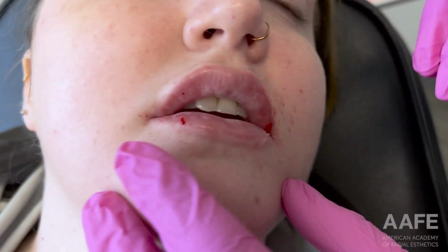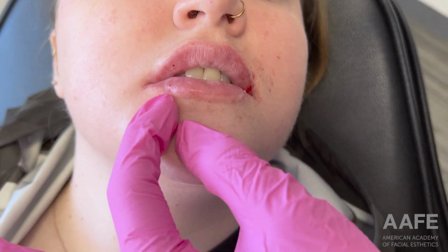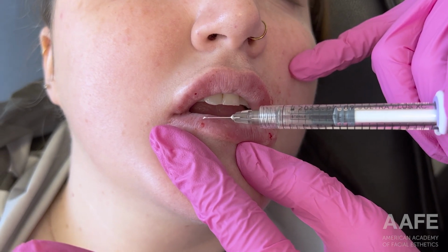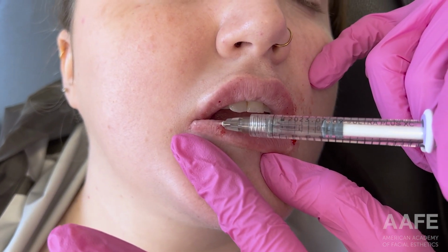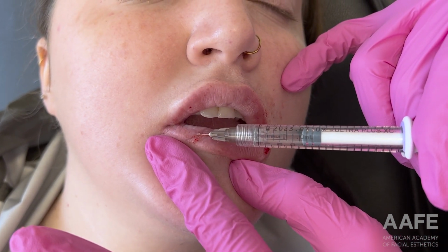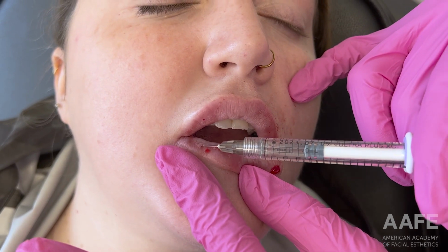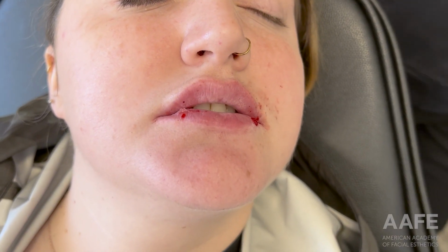Turn towards me, please. I'm going to wipe her just slightly. And I'm going to fill. You can see here where that filler kind of falls off. You can see it's nice and hydrated and plump. And we just need a little bit more in this corner. Always checking my depth and laying a nice, healthy retrograde injection there, and I'm going to put just slightly more. You doing okay? Mm-hmm. Good. And I'm watching that tissue fill.